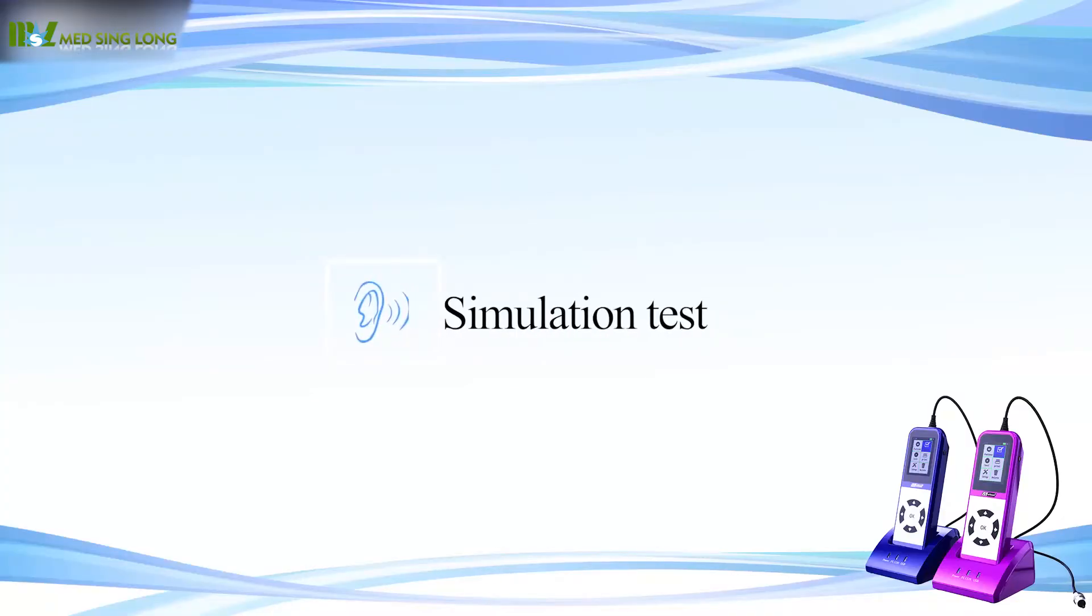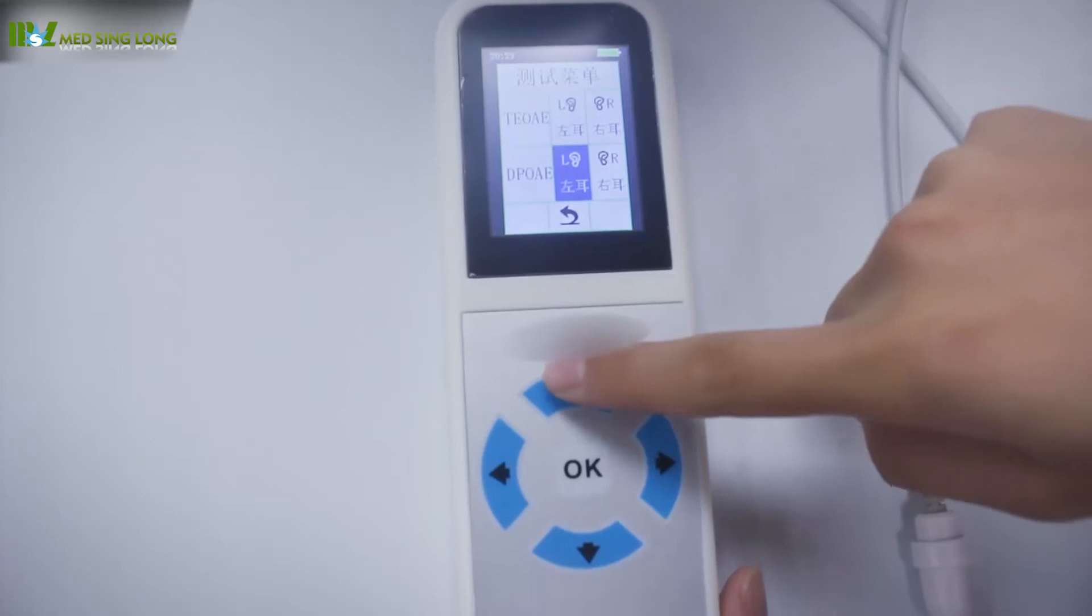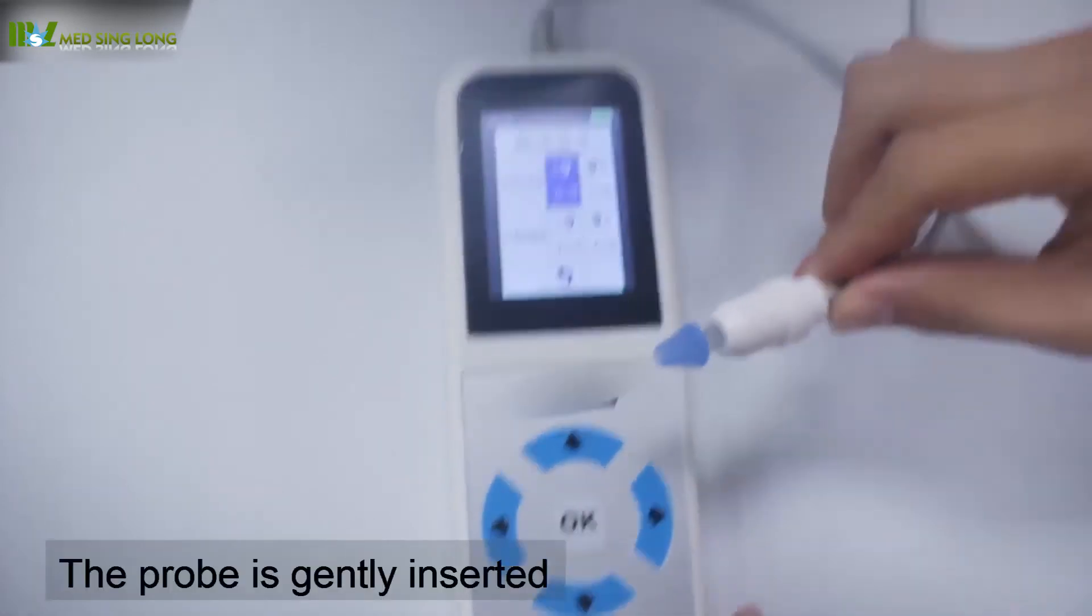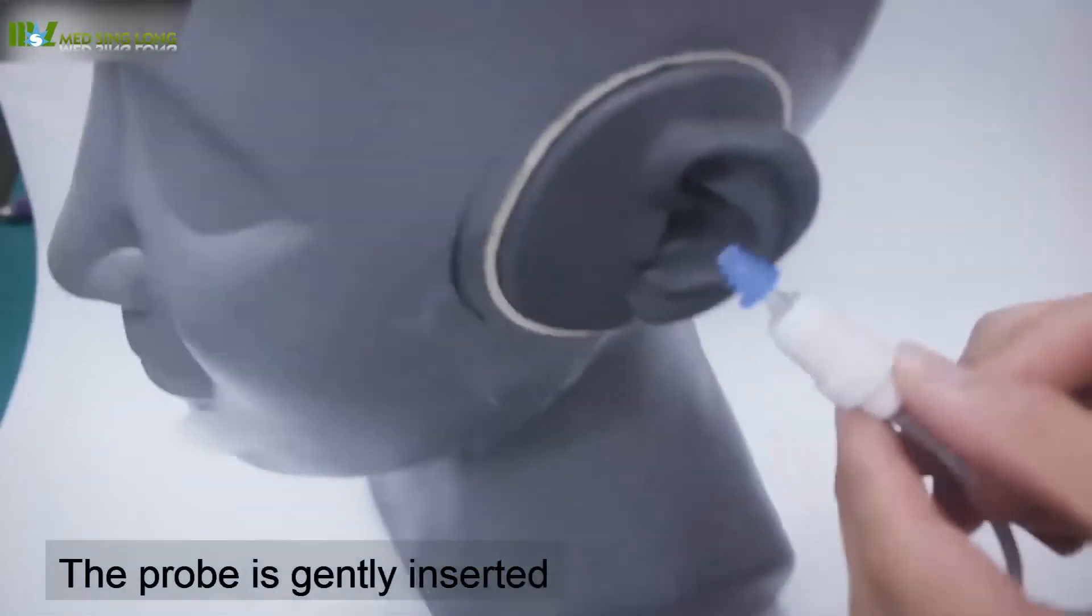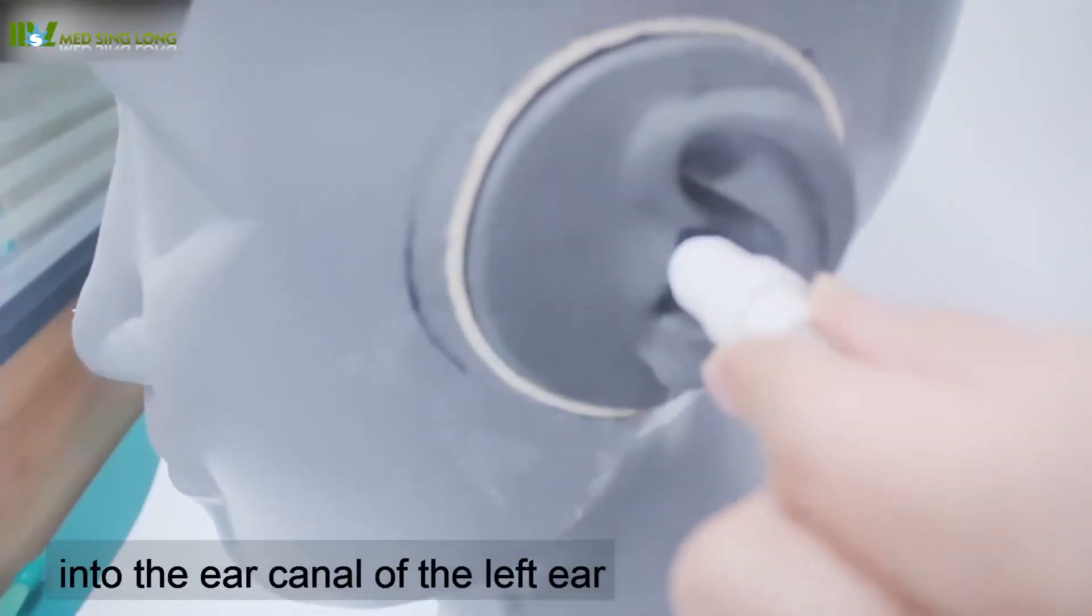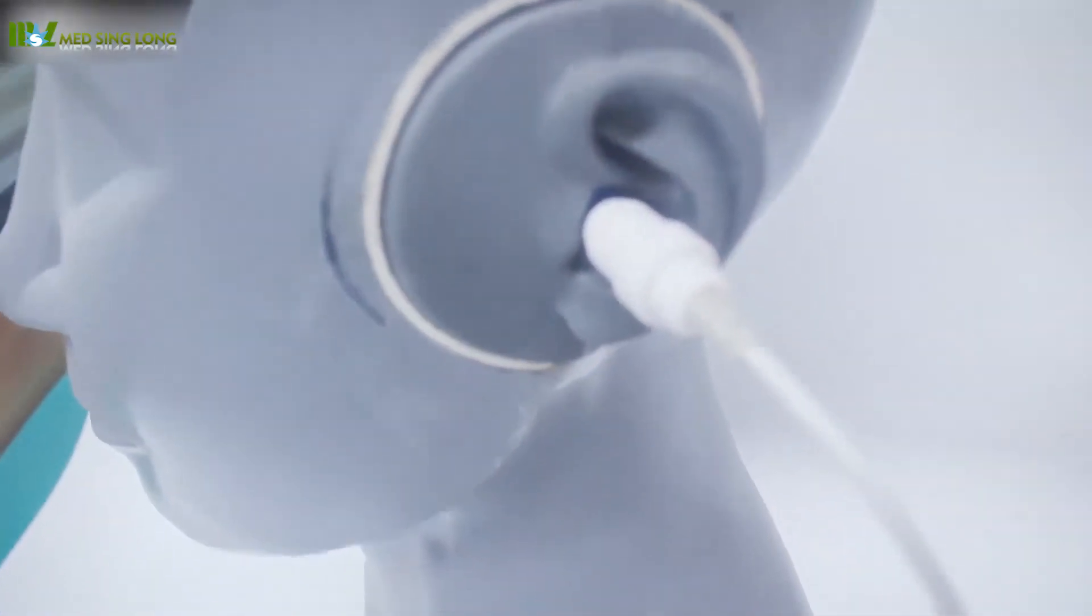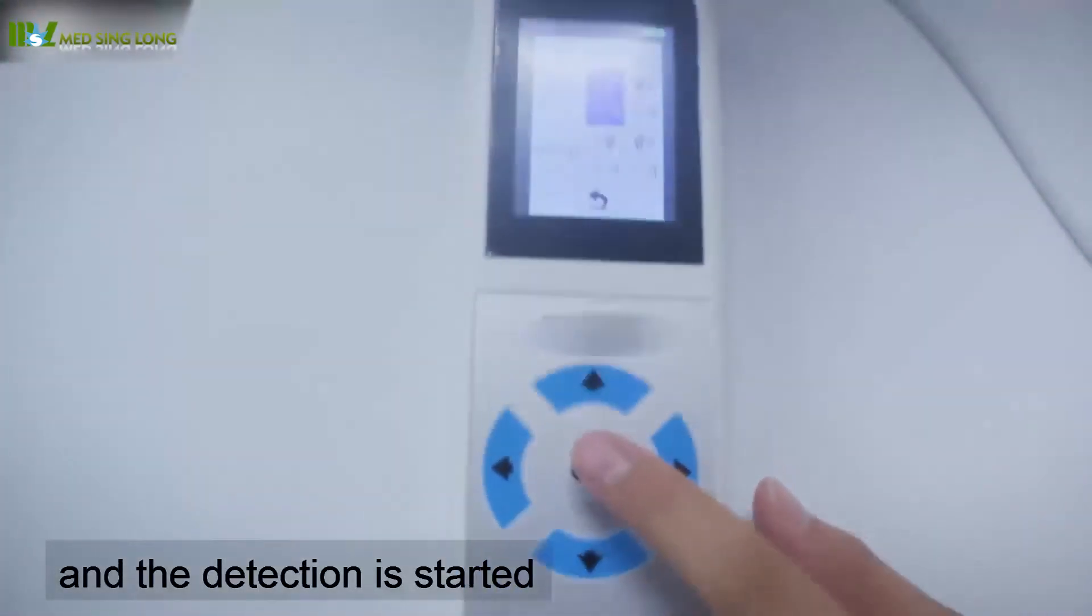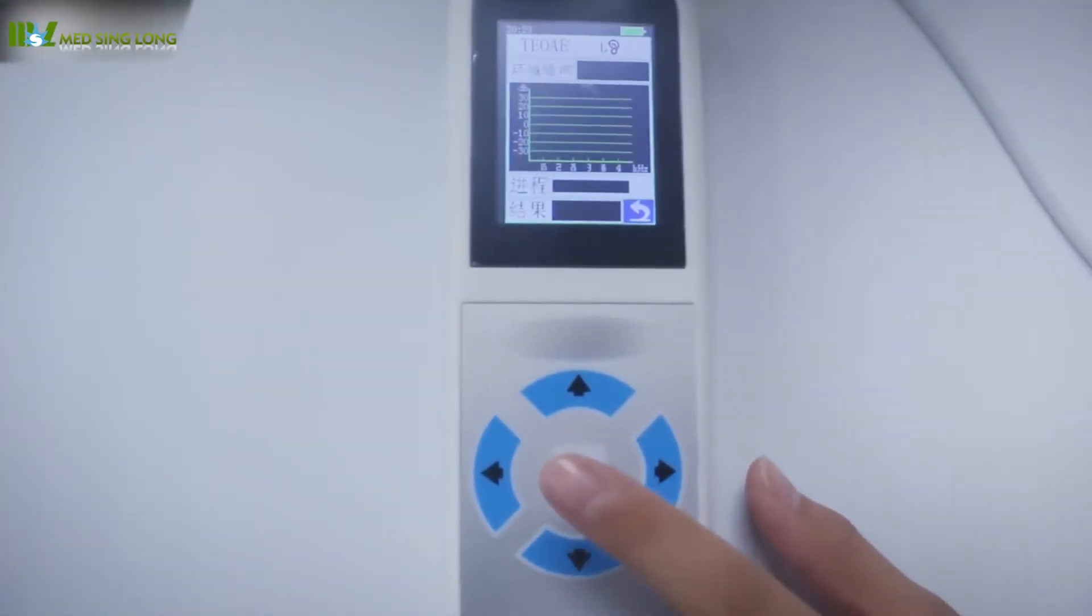Simulation test: The probe is gently inserted into the ear canal of the left ear. The detection is started by clicking OK.